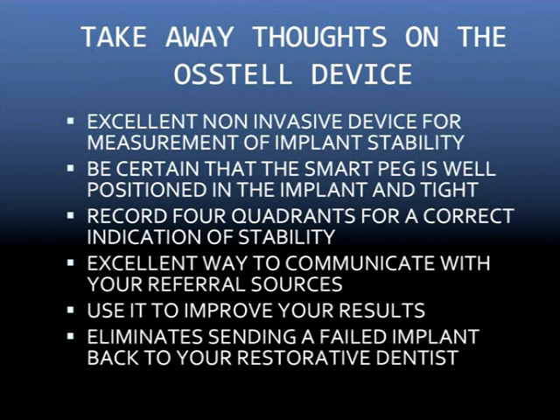Buccolingual versus mesial distal. You may be able to tell, at least subjectively, where the weak point on the implant is. For instance, these anterior maxillary implants that you're early loading, you certainly don't want these implants in a protrusive load because you'll see, if you start doing a lot of this, that the weak point is buccal and often palatal. So it may suggest where the weak point is.